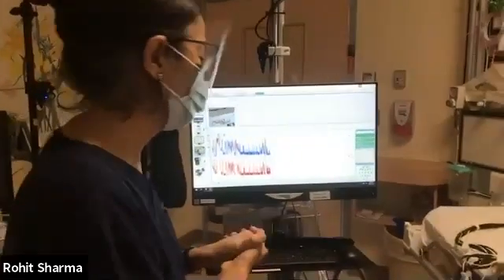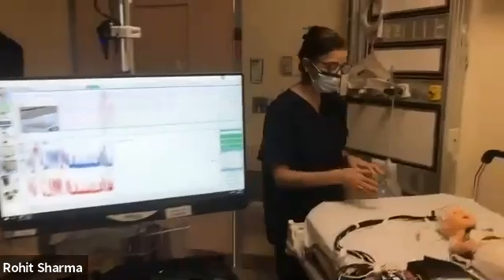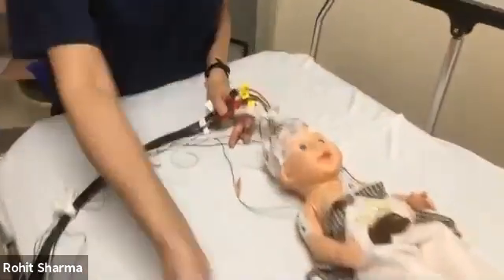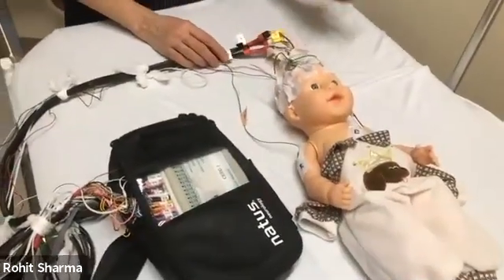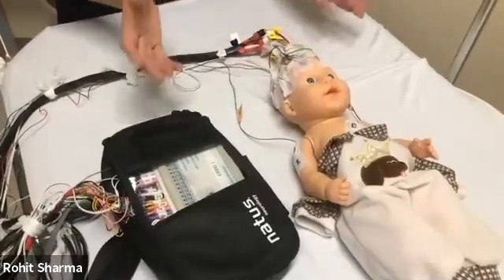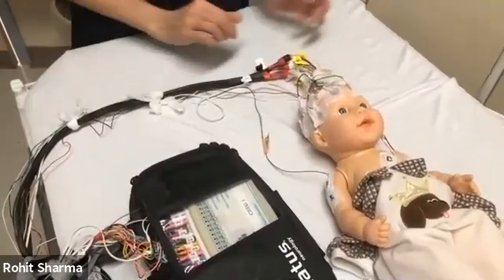The patient that we do nowadays, as you'll see over here, we have a little doll. This baby has CT MRI compatible wires. These wires are able to go into both the CT and the MRI scanner without causing much artifact. In order for you to go to CT or MRI, first you can make a note going to CT.